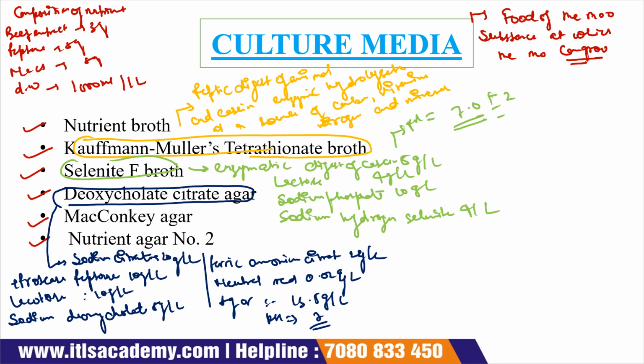MacConkey agar contains different ingredients, and the list of those ingredients is as follows. MacConkey.